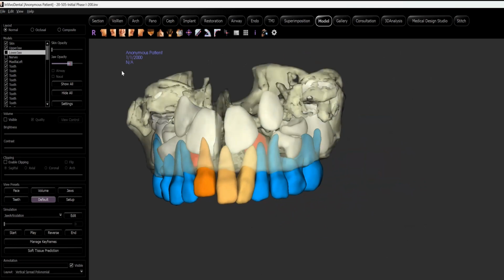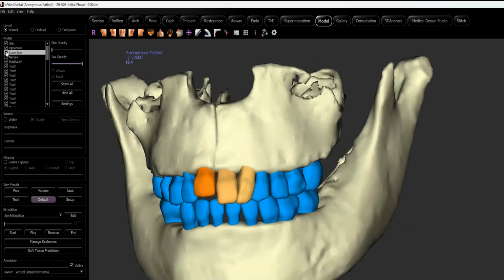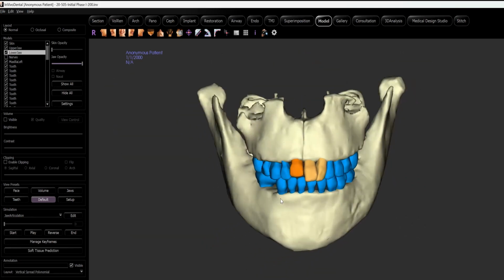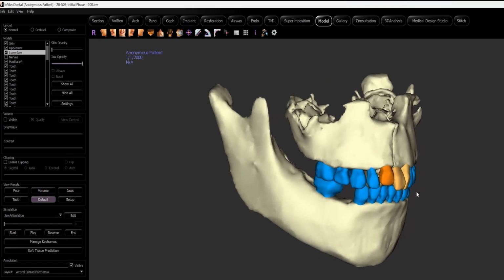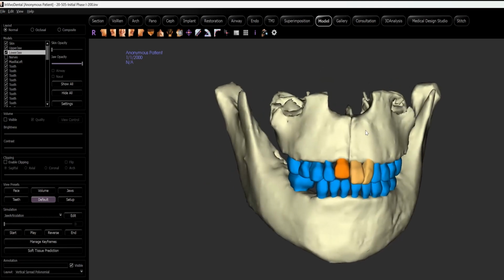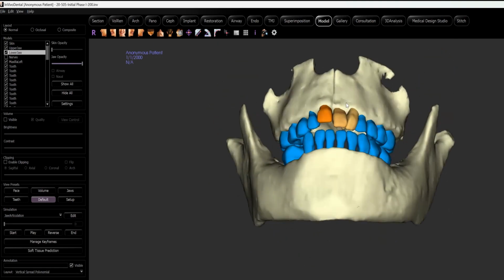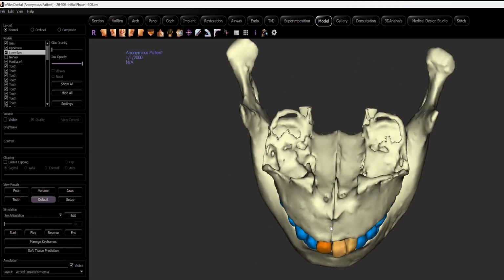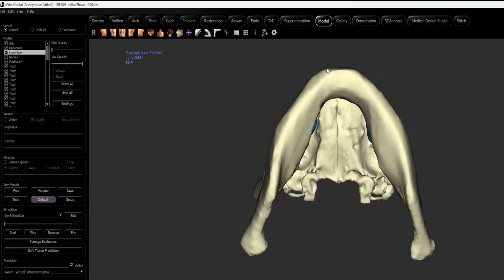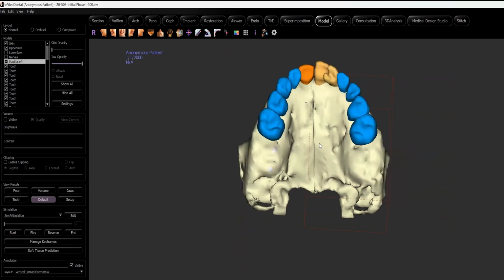One of the things that I get on our in vivo models, and I believe that this is not an extra cost, and this is an evolution of the in vivo model, it wasn't always like this, but we've been able to now make it standard that I want the condyles, I want the joints, and I want the palate, nasal floor with the maxillary suture present so that I can simulate some of these movements, right?